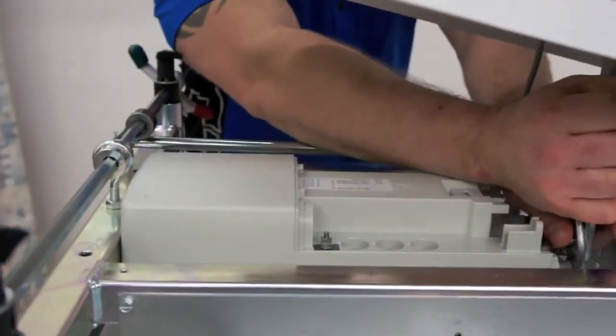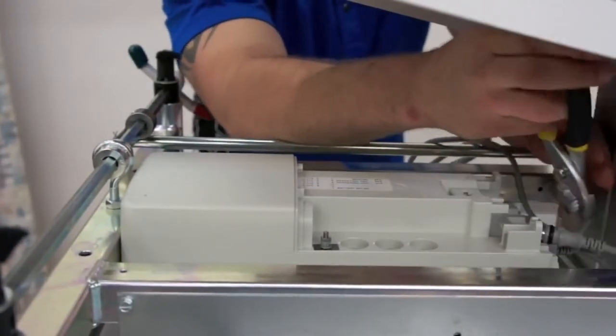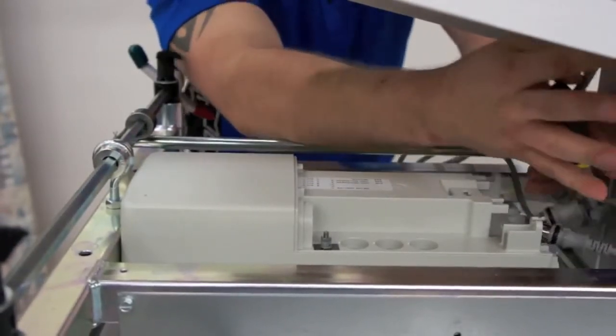Using your pliers, remove the wires from the control box, holding the strain relief when pulling the wires out.